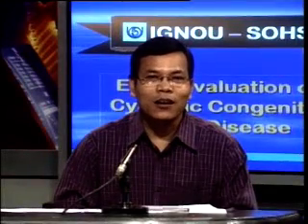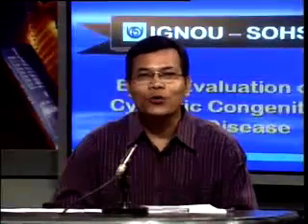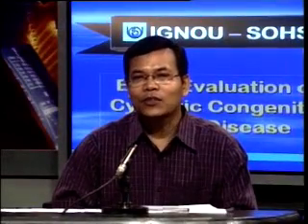Again I am trying to tell you, please don't look at the ECG as a single component, as Dr. Radhakrishnan informed you repeatedly. It has to be in combination with all other clinical findings along with the age and other things, and you are definitely not going to diagnose the anatomical lesion; rather, you are going to find the physiological process, and the ECG will help you to narrow down the differential diagnosis. There are many stages of diagnosis, so ECG is one of these things.